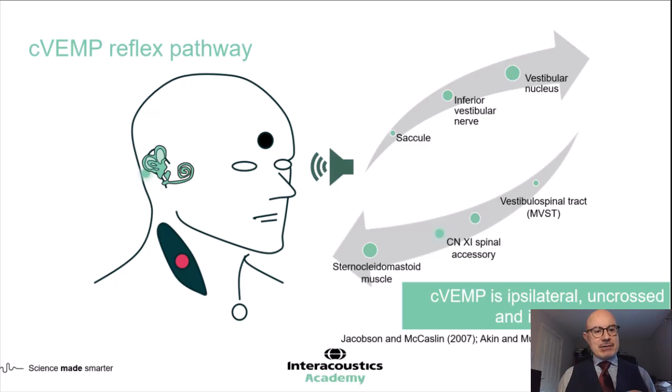So these are ipsilateral responses. In other words, what we're saying is if I stimulate the right ear, I'm recording from that right ear, and I'm actually also recording from the right part of the neck muscle as well.